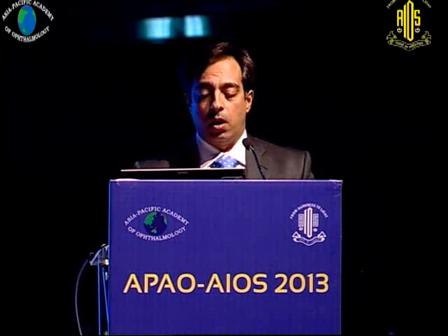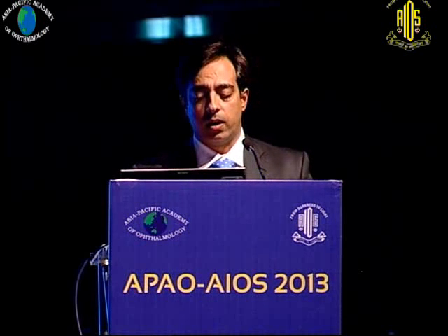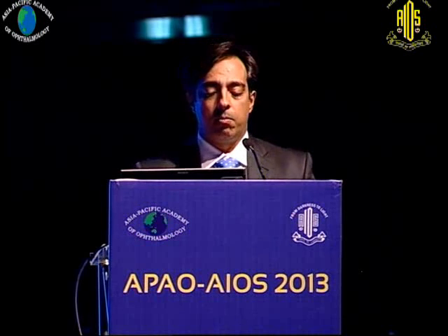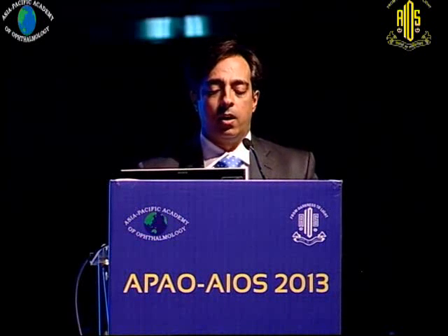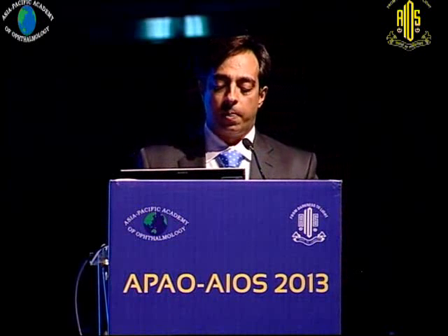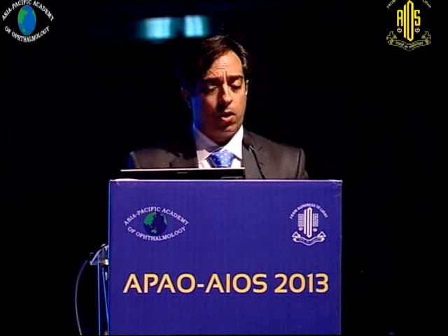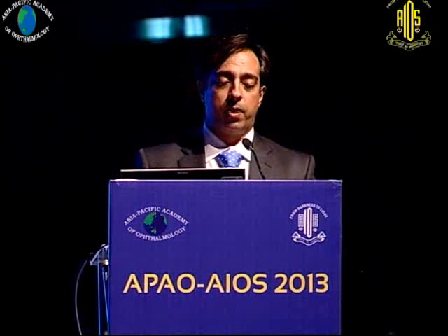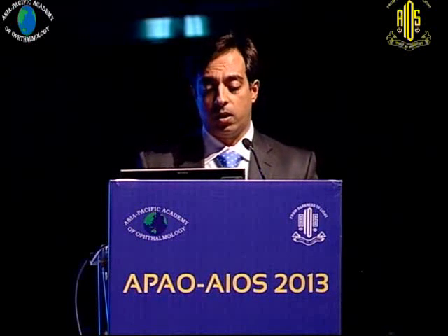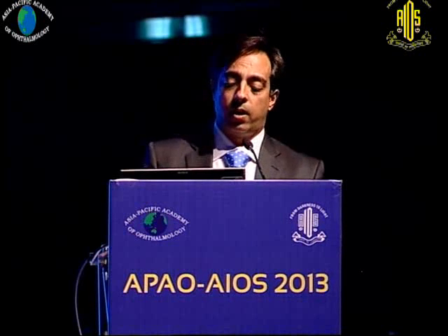So it's usually in a liquefied state. All you need is a good suction at that stage, and the cutter can be very easily taken there, and by a painting movement you can remove most of these adhesions, and whatever is bleeding because of the scaffold, the proliferations, one can raise pressure and then go back and diathermize those areas to clear that. So in vascular cases, one needs to have an alternative way of approaching that.